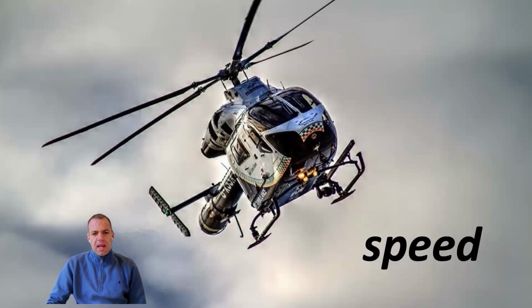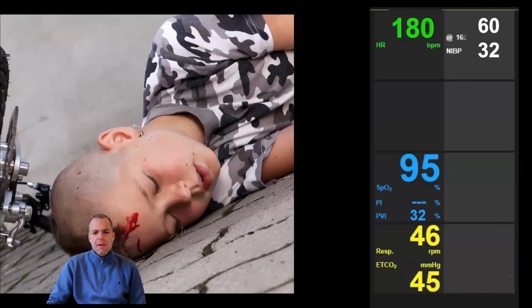Now, when we get to a patient like Harry, one of the first things that any emergency pre-hospital responder will do is attach them to some form of monitoring. And this is crucially important. So in Harry's case, the numbers might look like this. You can easily stand out, see that he's tachycardic, his blood pressure is low, his oxygen level is not ideal. Now, physiology is going to inform how we handle any of our patients, whether they're medically unwell from stroke or sepsis or an MI, to those injured patients who might be bleeding or having a head injury. A lot of our clinical decision-making is directly related to what we see on the monitor.